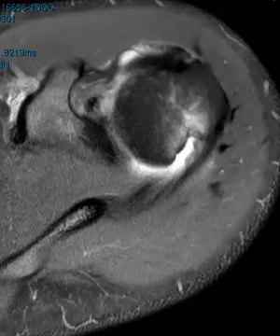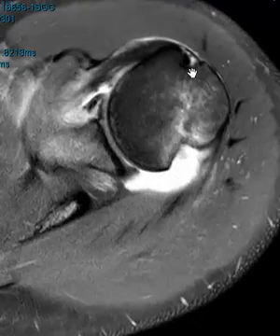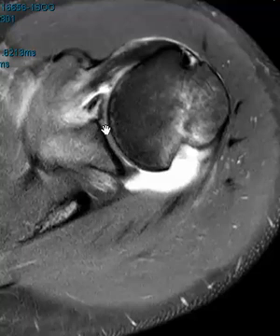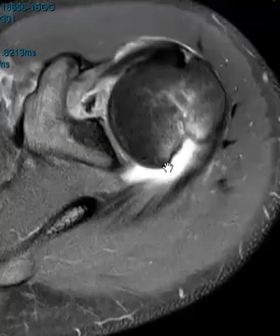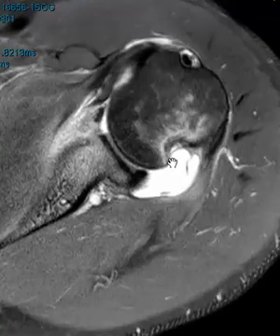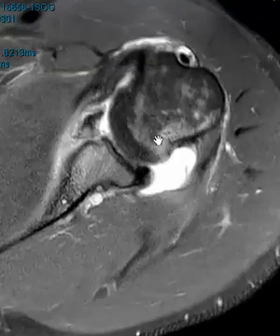On this axial PD fat sat sequence we can see the round humeral head. Here's the front, here's the outside, here's the glenohumeral joint. The posterior aspect does not look quite so round - there's a V-shaped defect, a really deep defect in the posterior-lateral humeral head, and there's surrounding marrow edema.